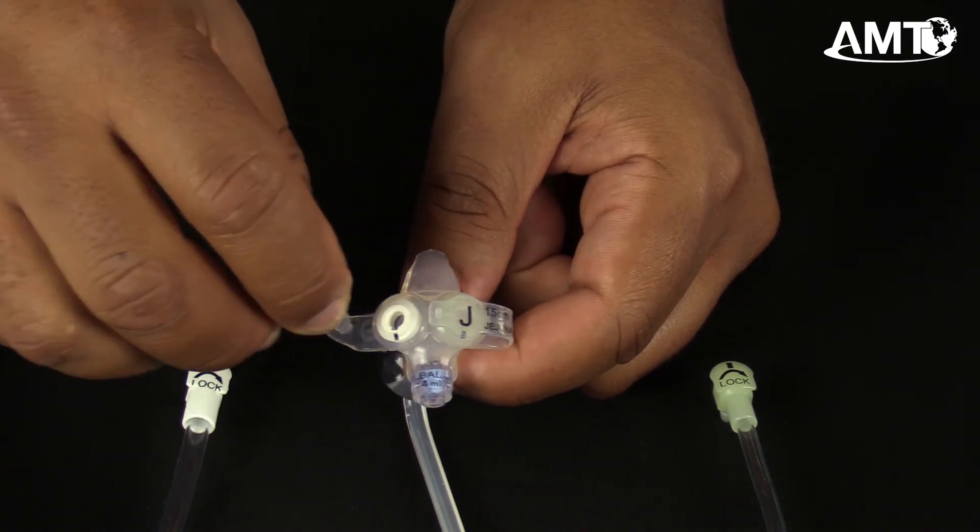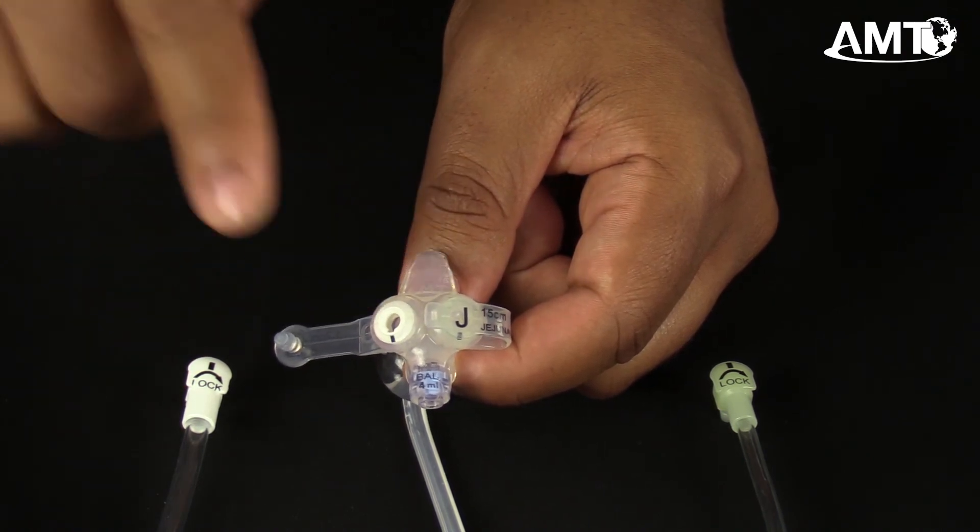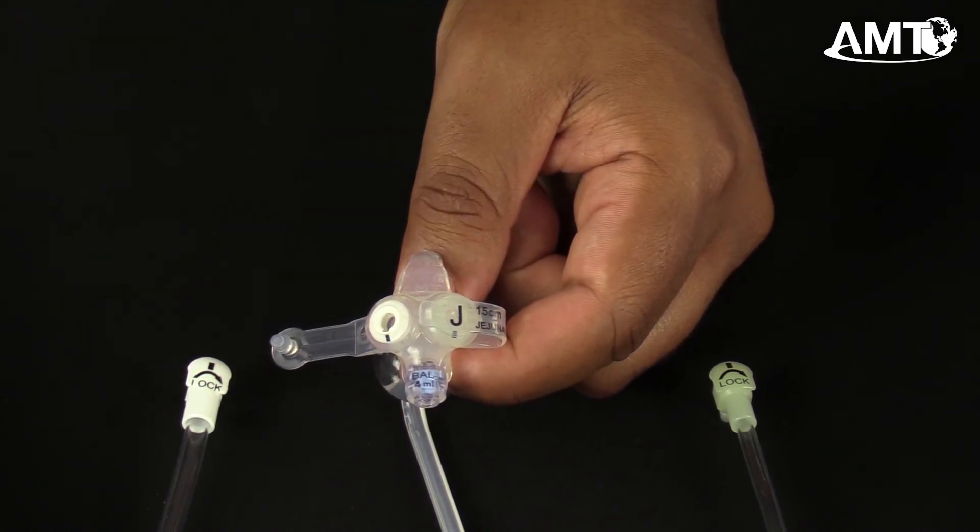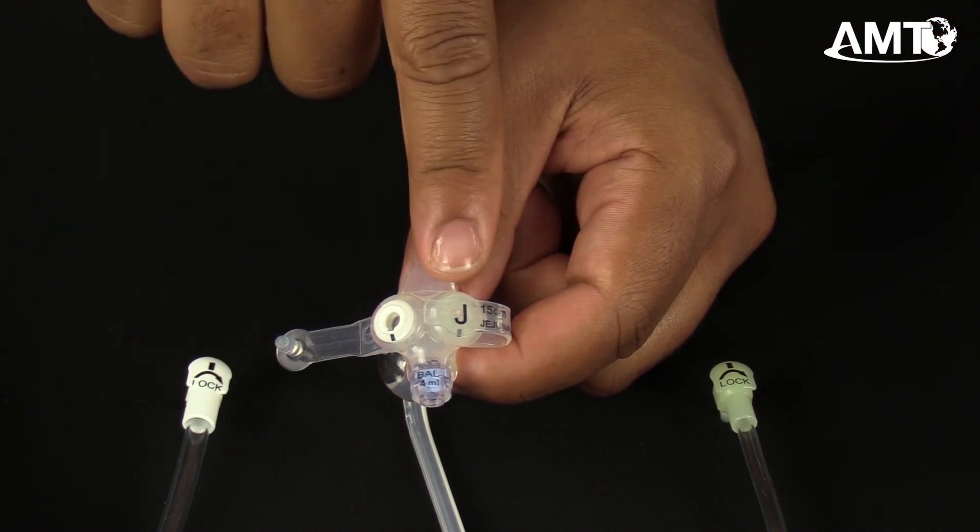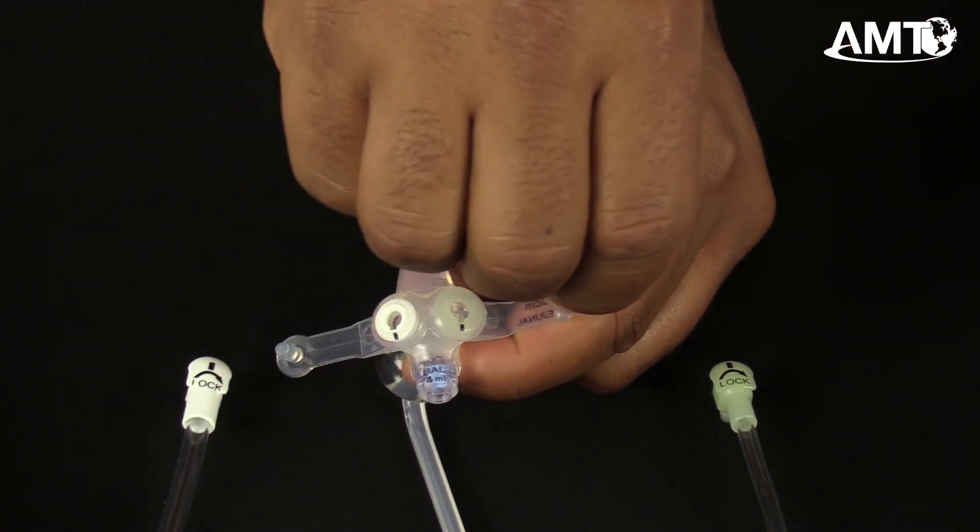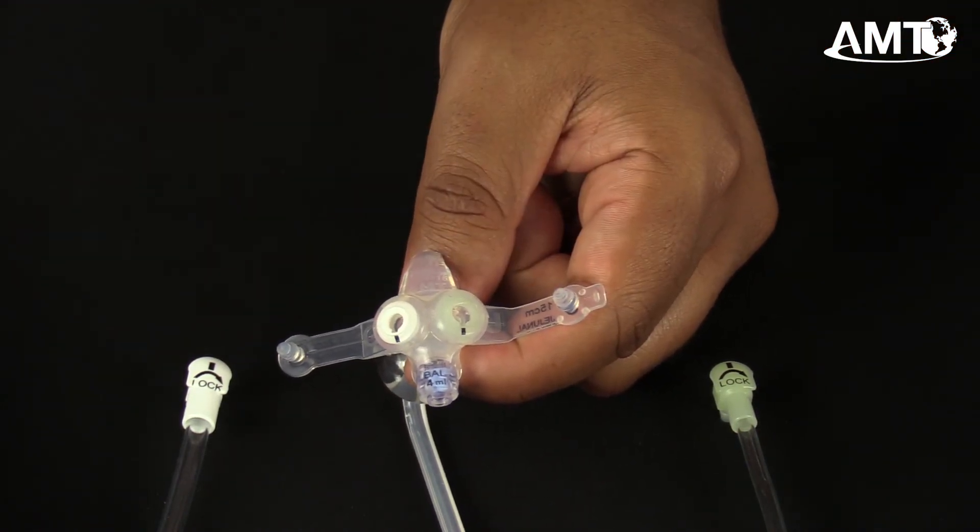The gastric extension set will only properly lock into the gastric white port, while the Jejuno feed set will only properly lock into the Jejuno glow green port. Both ports feature an anti-reflux one-way valve.